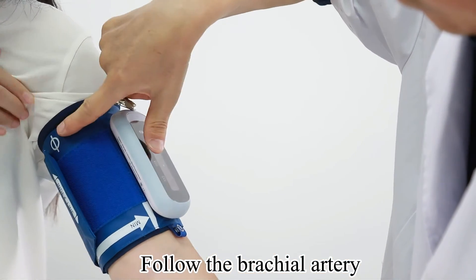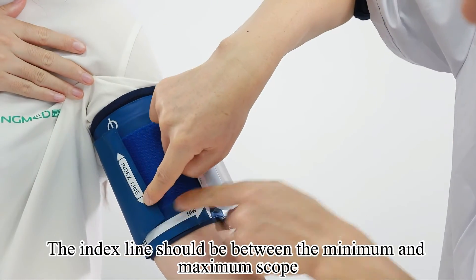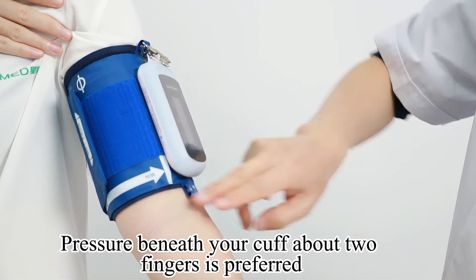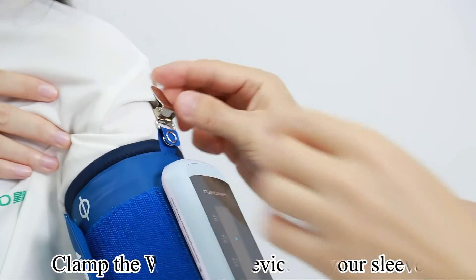Wear the WBP-02A following the brachial artery — the artery marker is on the top. The index line should be between the minimum and maximum scope. Pressure beneath the cuff of about two fingers is preferred. Clamp the WBP-02A device on your sleeve.